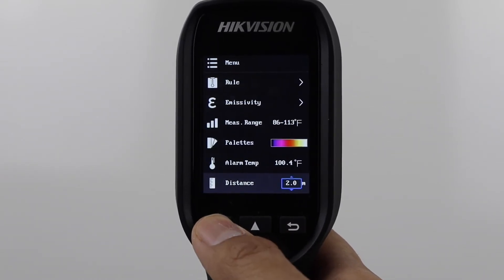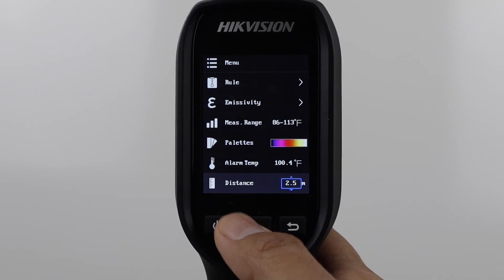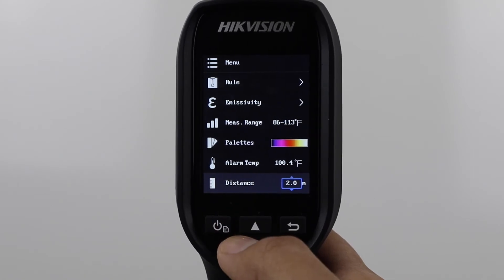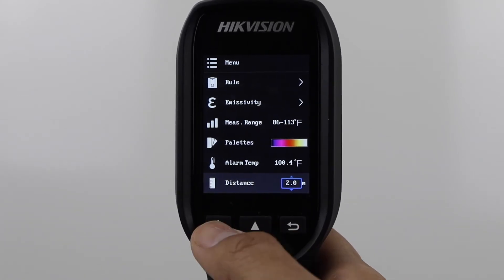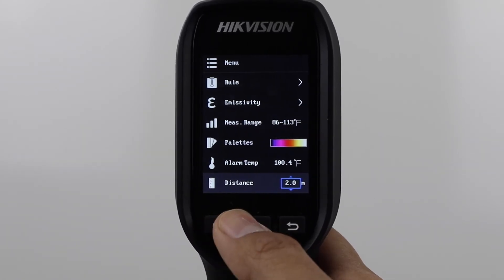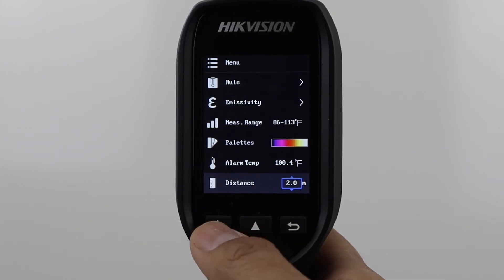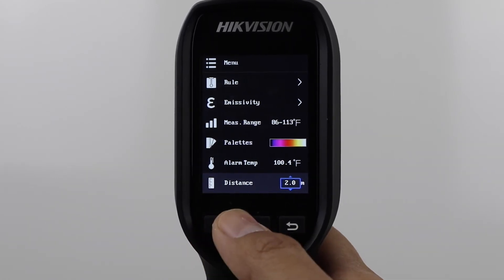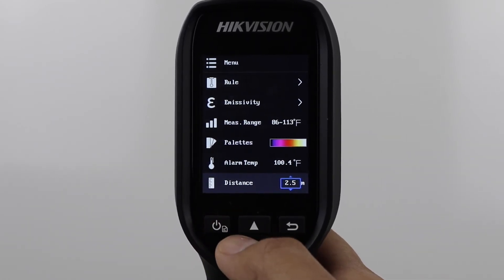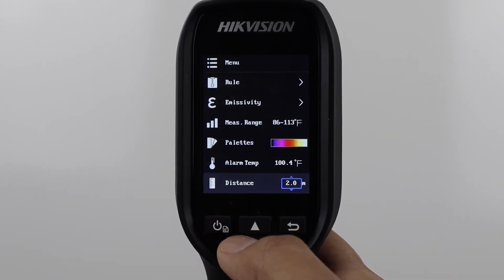Distance is crucial for accuracy. Here you will set your measurement distance from your target. You can increase this up to 3 meters, but we recommend using a 1 to 2 meter distance.